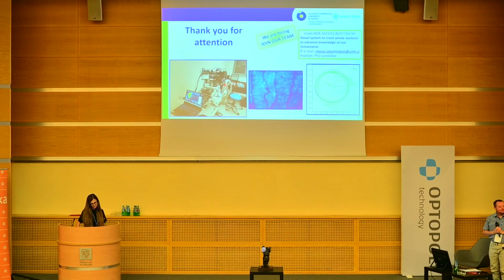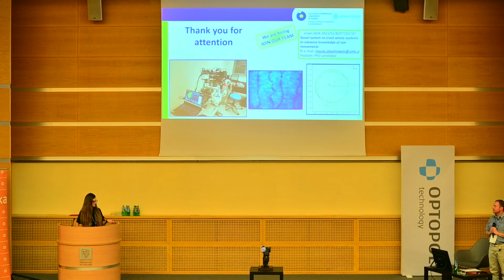Thank you very much. It's very impressive, very advanced technology indeed. I have a question. Am I right that the accommodation should be in some way paralyzed or set to a certain stimulus to get these measurements? Our idea is that we want to have a fully clinically available device, so we only focus on measuring the patient without tropicamide and so on. So it should be natural. The idea of this research is that we don't want to touch the patient.